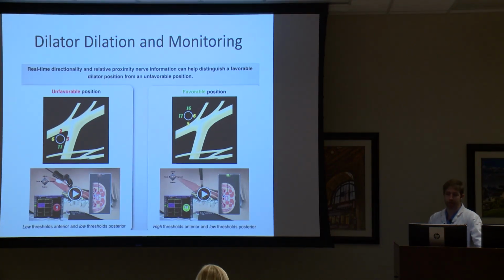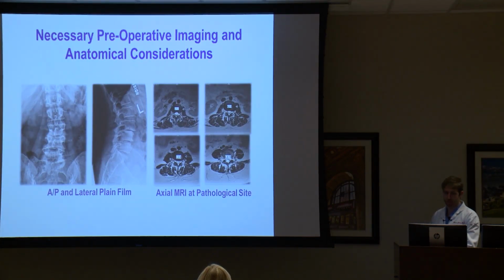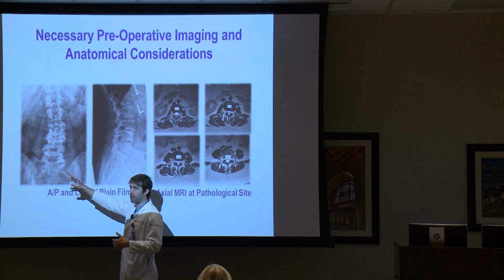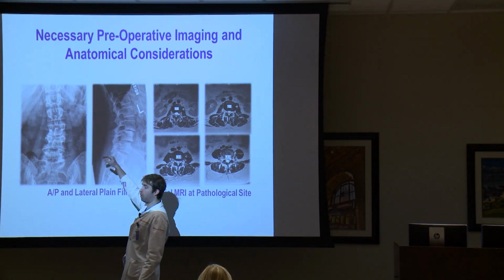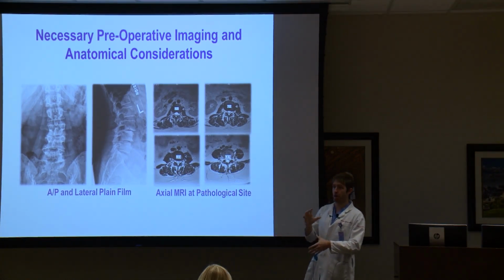Medtronic and NuVasive have really large degree wedge cages. And so for what I do, I like to make sure that we always restore, let's find a good picture of it, this curve on patients, right? You don't want to fuse them flat. You don't want their lateral to look like this, because they're going to get back pain and they're going to need some big procedure to give them a curve. From this end plate to the top of L1, so from L5 to L1, you should have 45 to 55 degrees of curve.